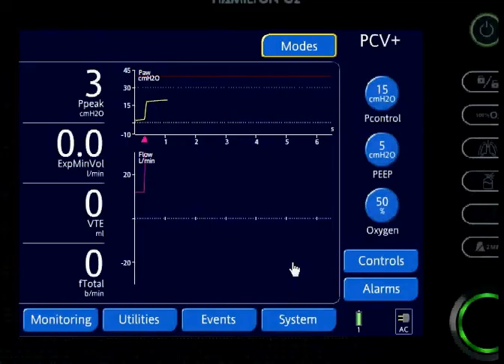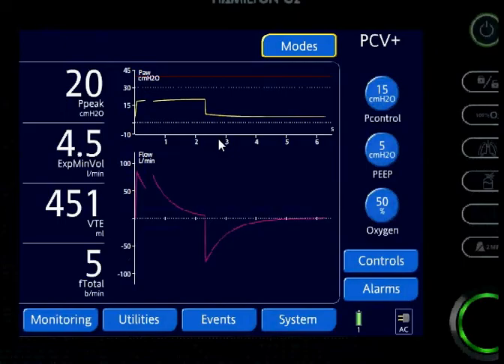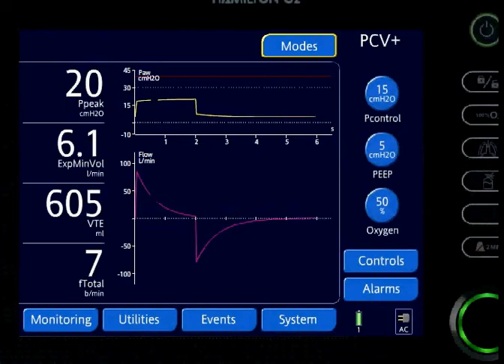I'm going to start ventilation. My set point is pressure — that's the feedback the ventilator is using. It's always looking at the constant pressure for a certain amount of time. Set point control is very basic and requires a lot of operator input to make adjustments.